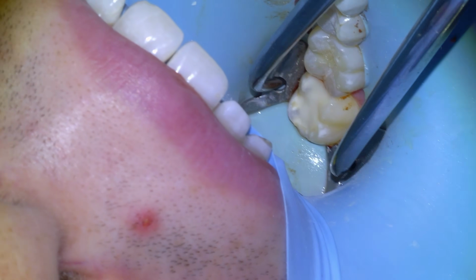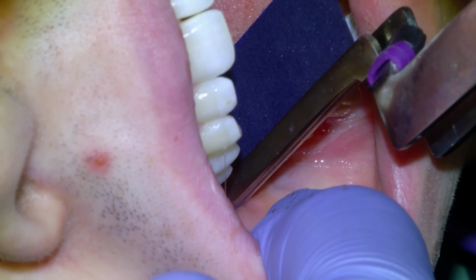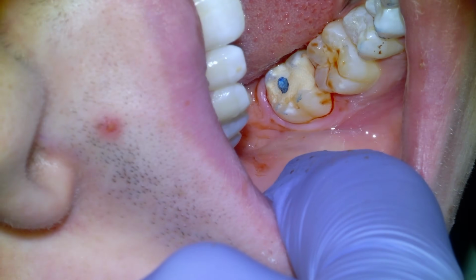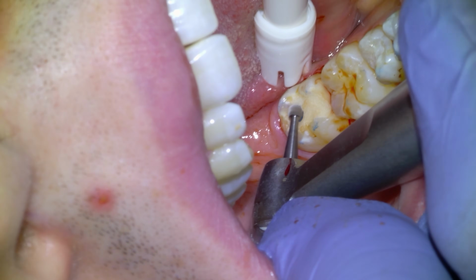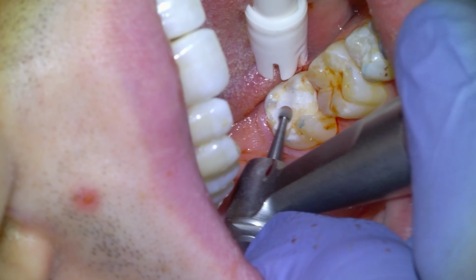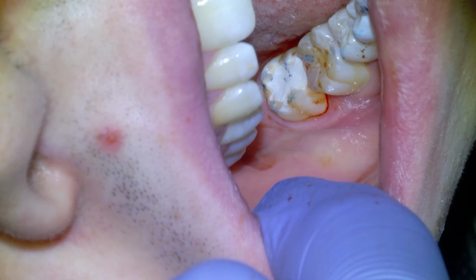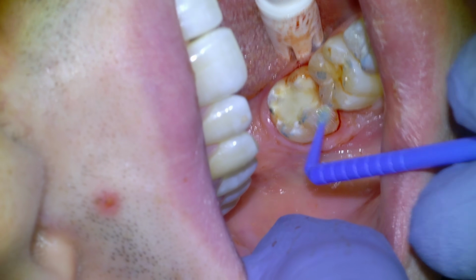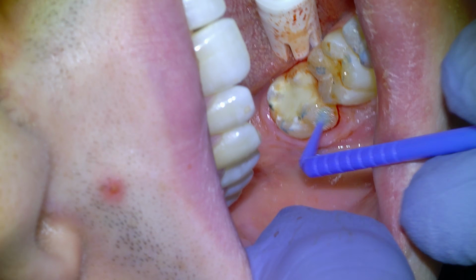Going to remove the rubber dam and check the bite. And we can see a high spot on the distal aspect of the restoration, so we're going to take it down. Spiffy up the margins, check the bite, we're happy. And then we're going to apply our coating agent. Give that a cure with the Valo, and then that's it for the restoration.